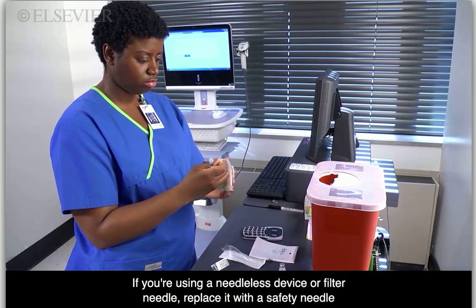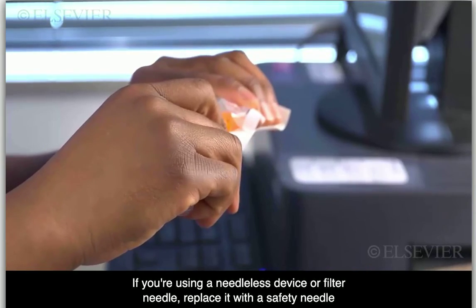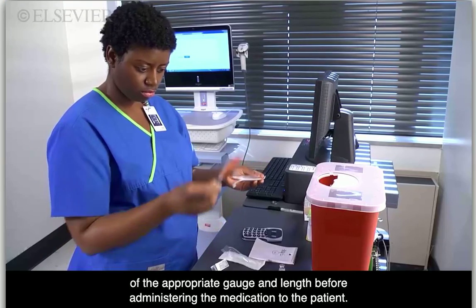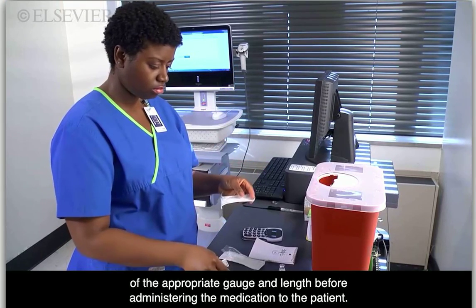If you're using a needleless device or filter needle, replace it with a safety needle of the appropriate gauge and length before administering the medication to the patient.